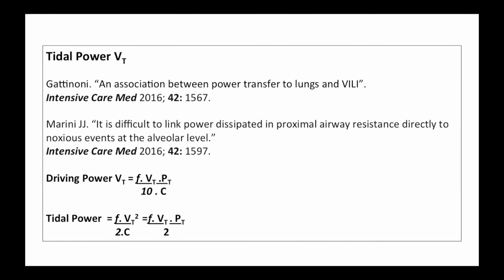Or could it be tidal power? There has been a report by Gattinoni and others of an association between the power that is transferred to the lungs and ventilator-induced lung injury. And there has also been a slightly different view from Marini and others, that it is difficult to link the power dissipated in the proximal airway resistance directly to noxious events at the alveolar level.